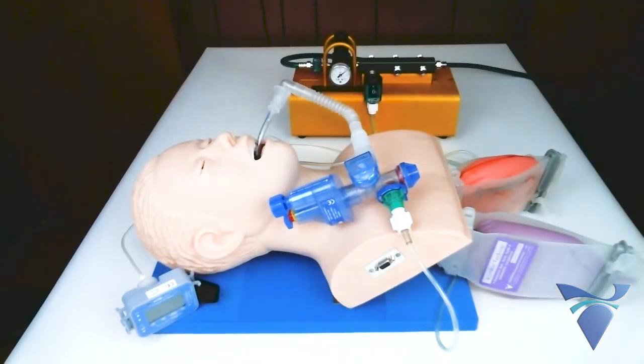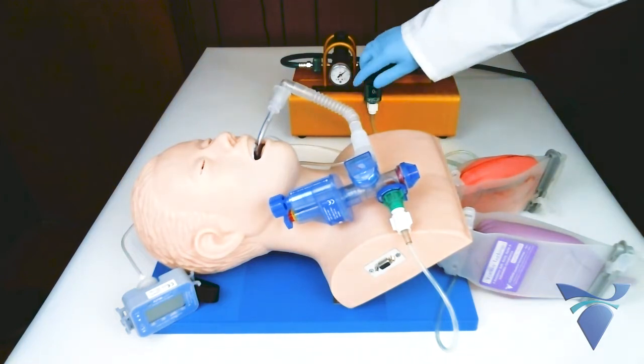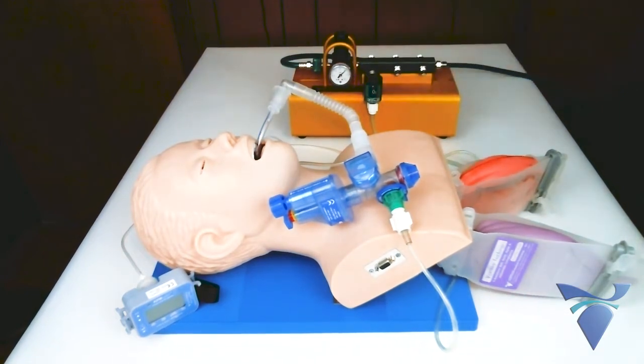During Step 1, the goal is to increase or decrease the flow meter until the desired inspiratory time is achieved. In this demonstration, the flow will be set to 25 liters per minute.